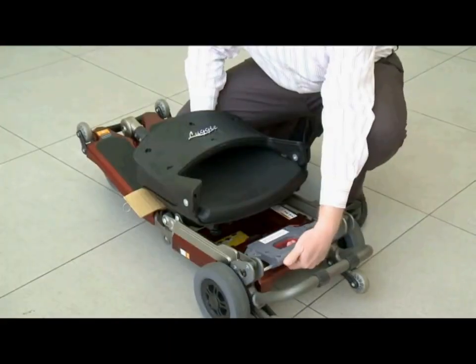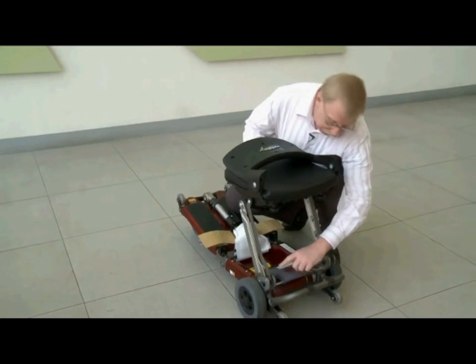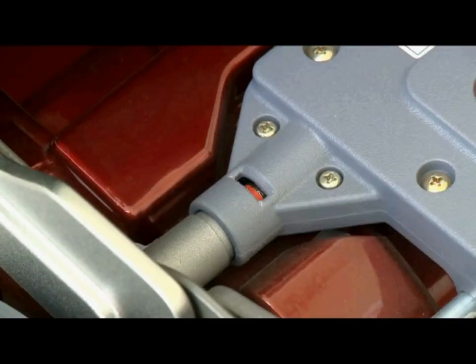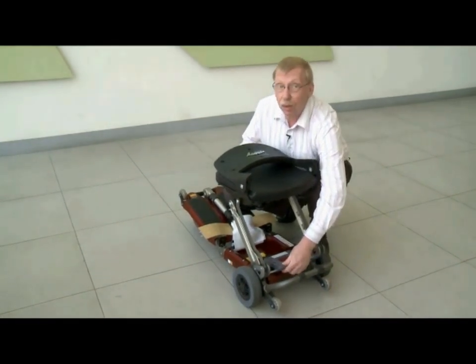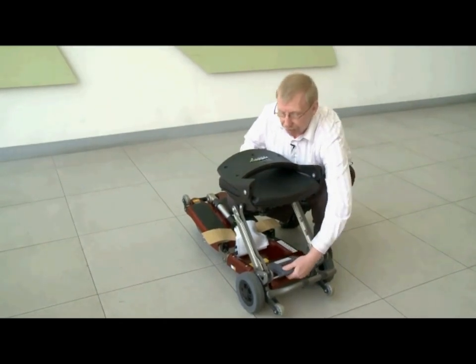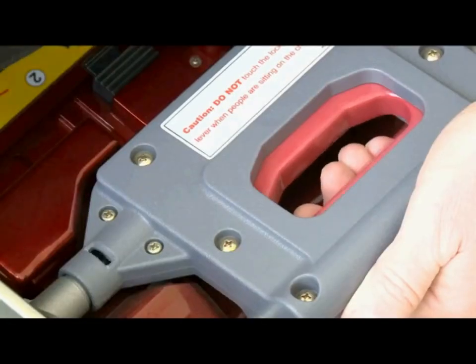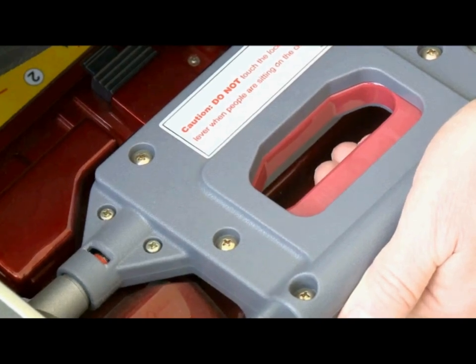This seat has three locked positions. Squeeze the red handle and pull the seat all the way up until it locks — you'll see the red indicator showing on both left and right side. Squeeze the handle again and let it drop into the lower position; again you'll see the red indicators. Finally, drop it down all the way until once again you see the red indicators.